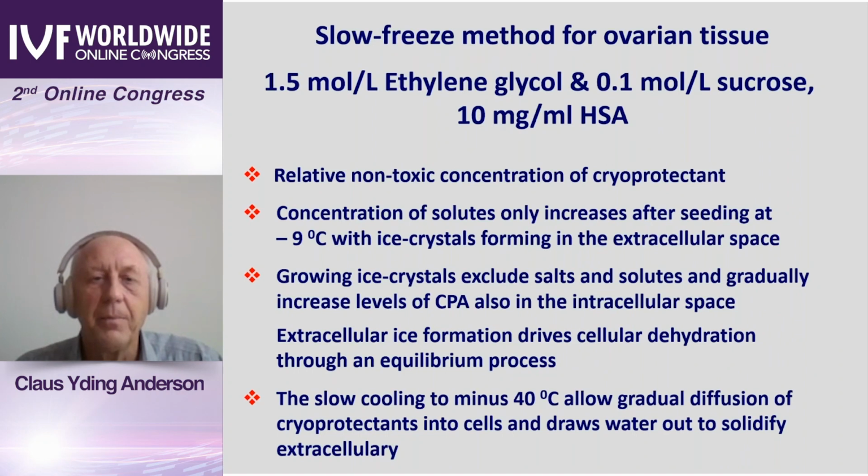The one we have developed in Denmark and which we use is the slow freezing protocol, where we use 1.5 molar ethylene glycol and 0.1 molar sucrose, and then human serum albumin 10 milligrams per milliliter, which is also very important.